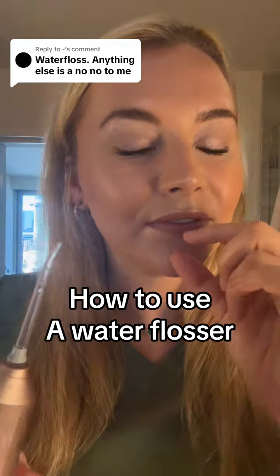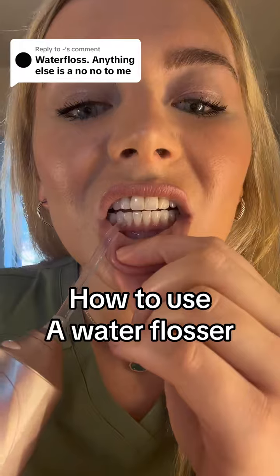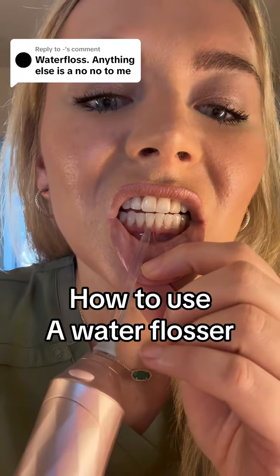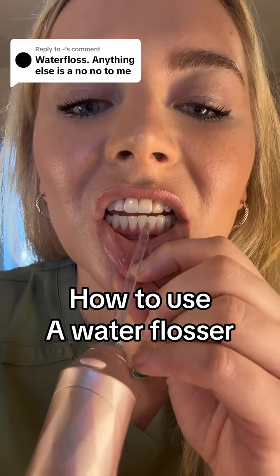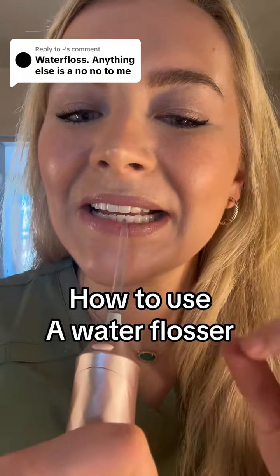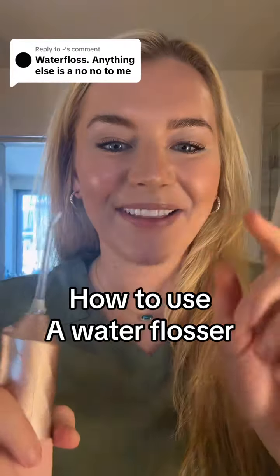Let's just work on these front lower teeth. The thing with the water flosser is you want to make sure you're getting it all around the bottom of the gums. You're going to take it right here and go all the way around with the water on, through the contact, and then down and up. What you don't want to do is what I'm about to show — that's not the correct way. This is the correct way.